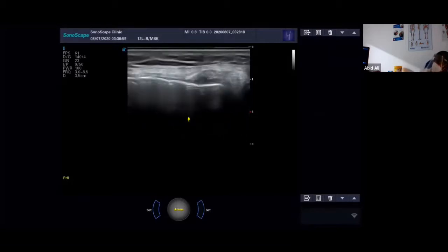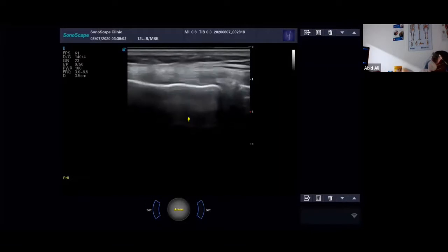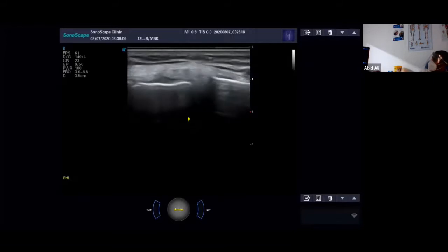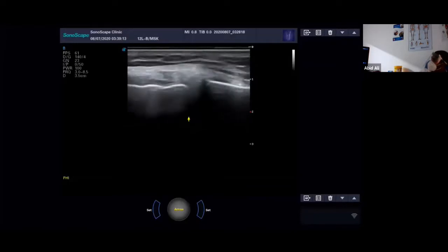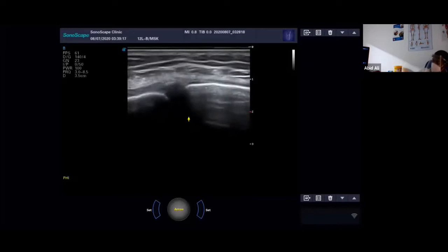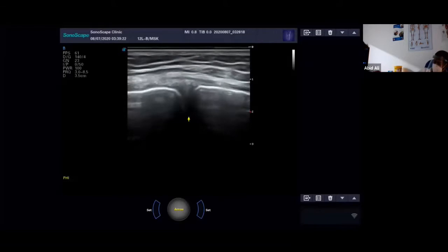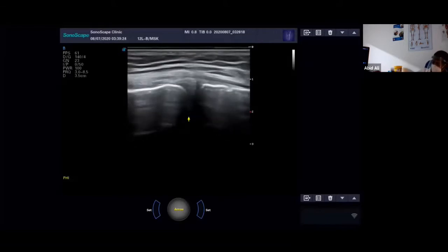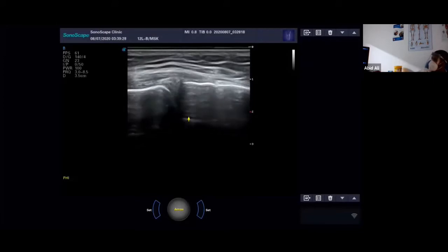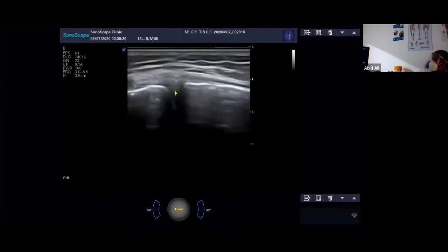Yeah, but it's also great for injection placement. Yeah, so you know exactly where you are in the joint margin. You can see I'm just rolling my finger, and we're just about over the joint margin there, from a little bit further down. Mark it. So I can just use that to locate the joint margin. That's what we do, just make a little fingernail mark there. And then obviously sterilise and do whatever. So you don't have to do it as a guided procedure as such. I call it an ultrasound marked procedure.